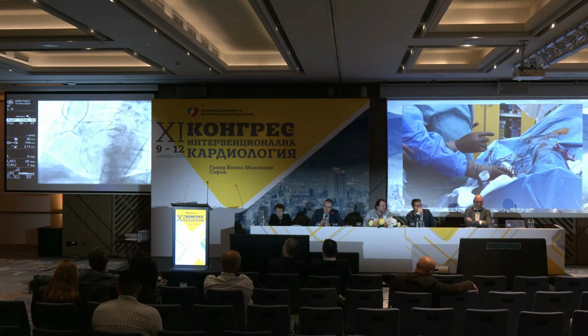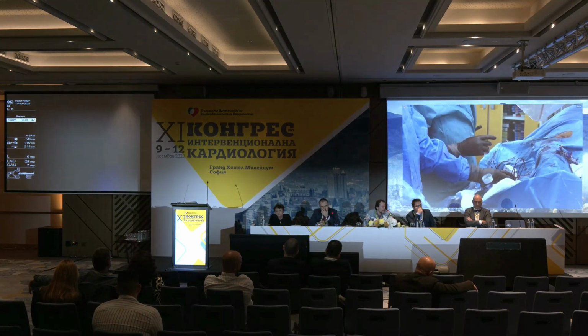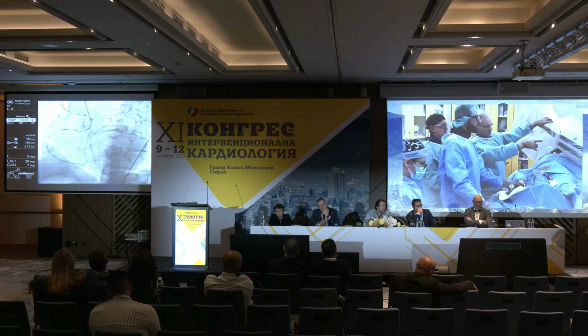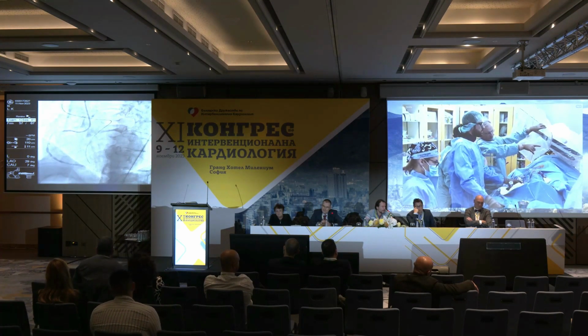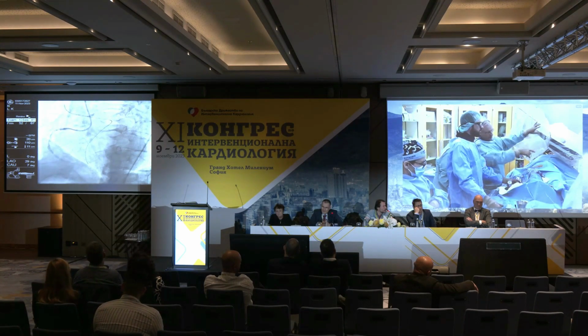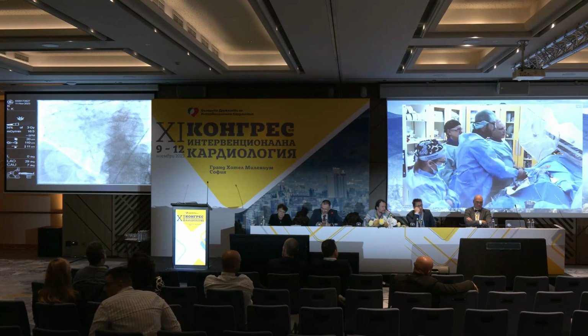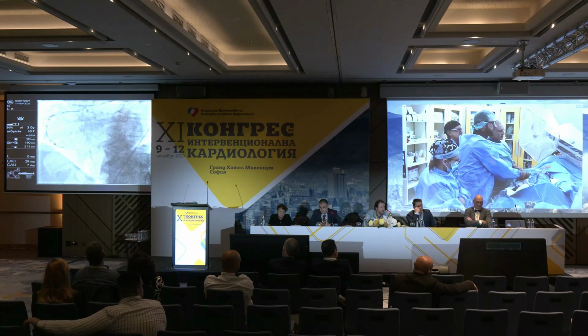So George, just from an educational point of view, just to make some chit-chat. When do you avoid antegrade giving contrast? You were sure here with the IVUS that you were true to true, and you are very liberal to give contrast. When would you avoid giving contrast antegradely?